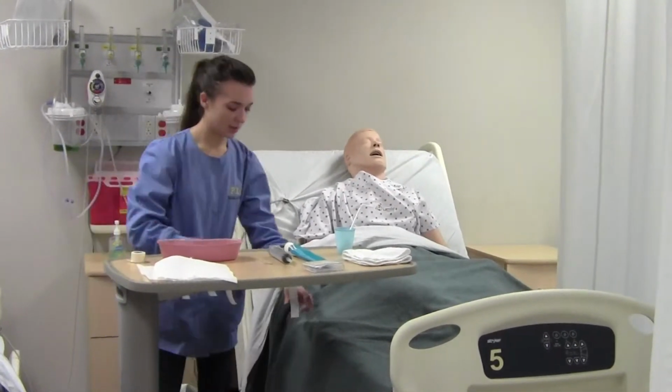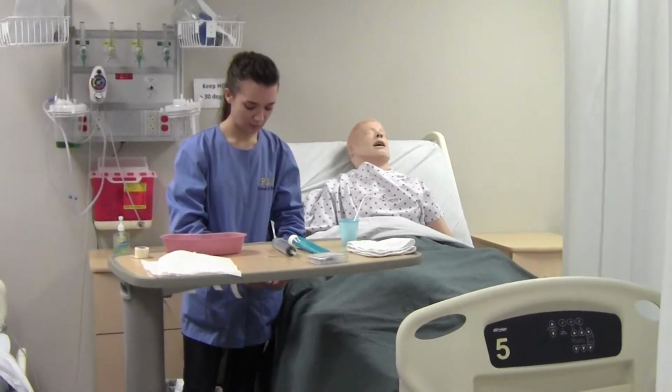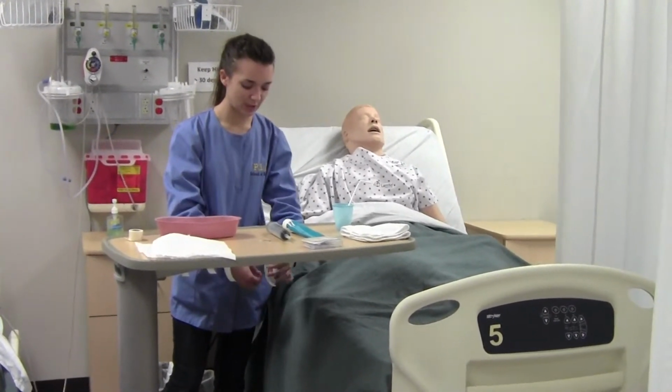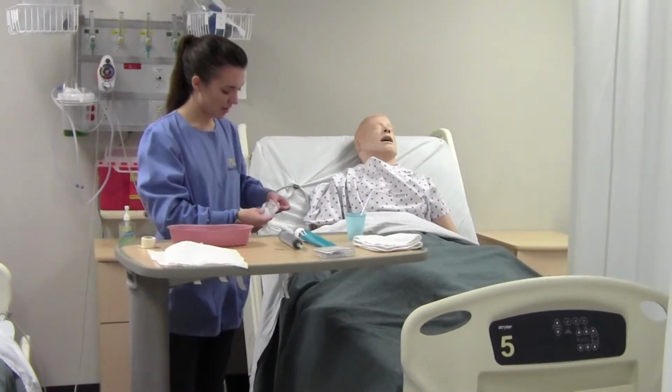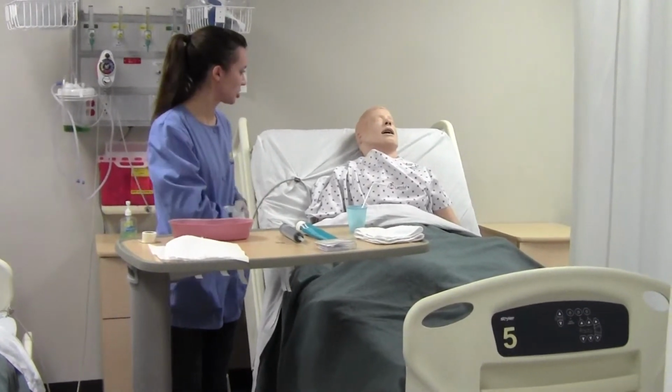Okay, I'm going to take this long piece and I'm going to split it right here. That will be for when we're securing the tube to you. Okay, so I'm going to put on my gloves here. Now, Mr. Templeton, before we begin, do you have any questions about the procedure?